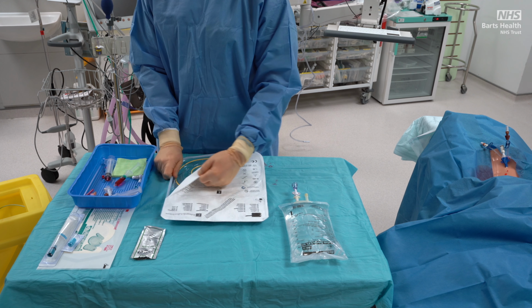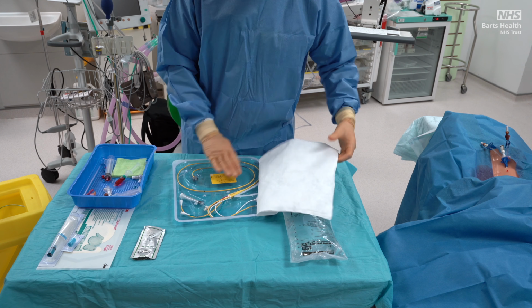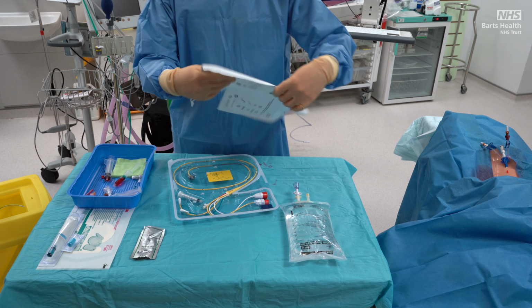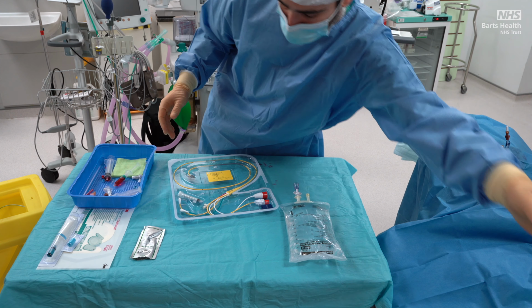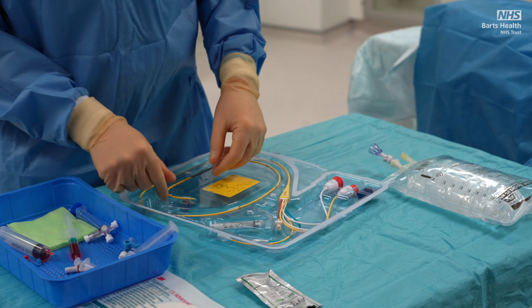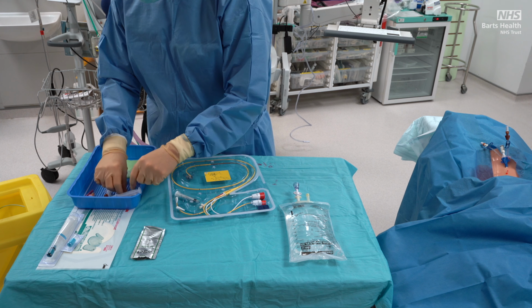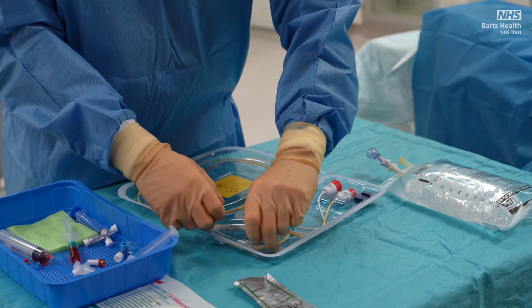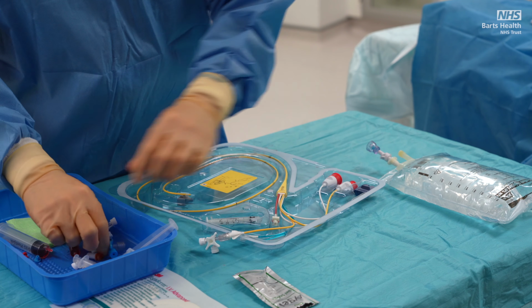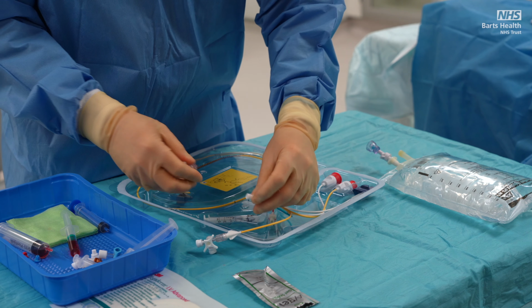Next, maintaining sterility of the operator, open and prepare the Swan-Ganz catheter. This will involve attaching 3-way taps to the yellow and blue lumens, flushing these with saline to confirm patency, and then connecting the 1.5 ml syringe included within the set to the red balloon port.